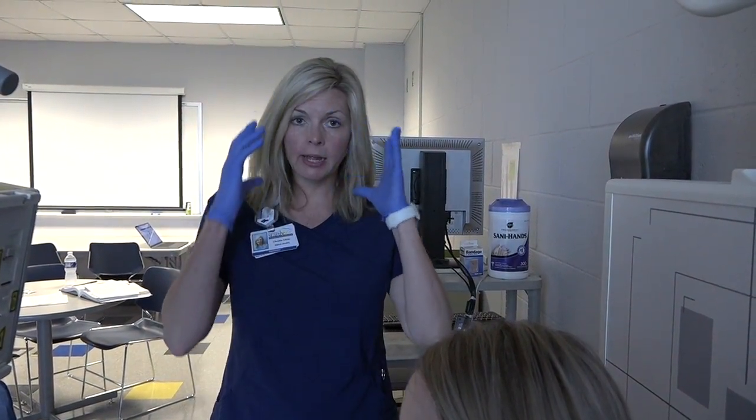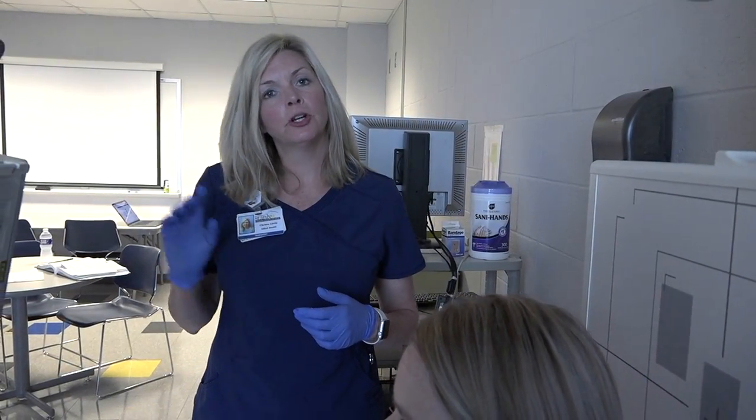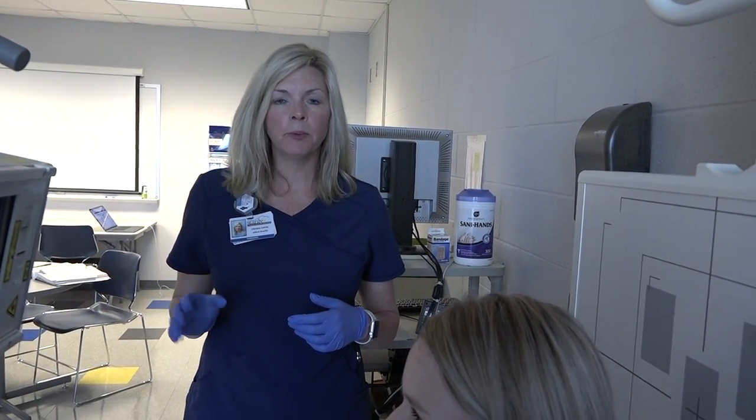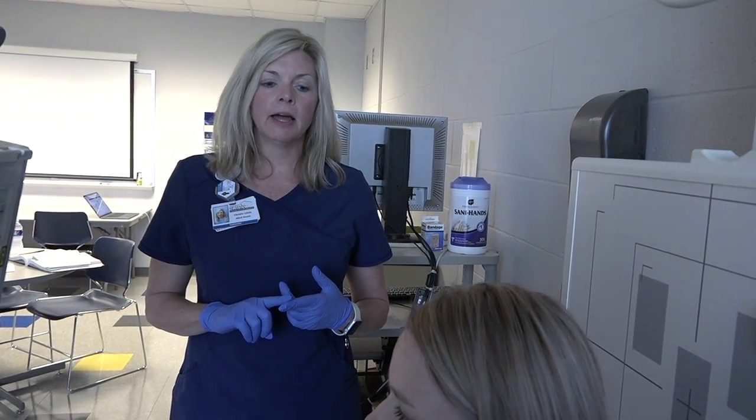Our next group of projections will be the facial bones, so we're looking at all of our facial bones together. Our projections will be the lateral — both sides — the Waters, and then the PA Axial Caldwell. Make sure you pay attention to your PowerPoint for the specifications for the technical factors and your specific centering.